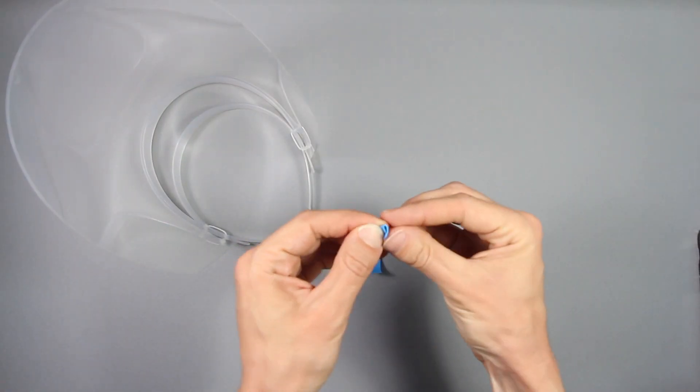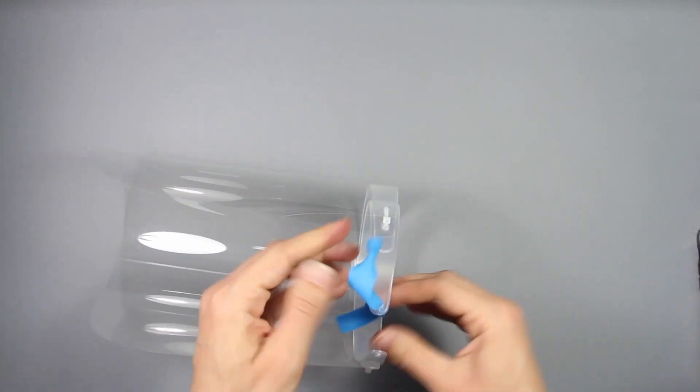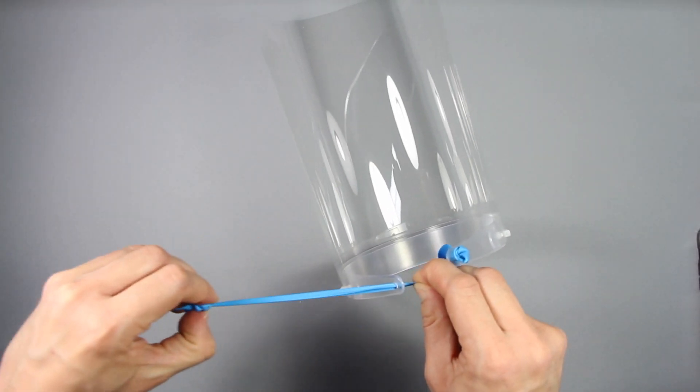Thread the end of the tourniquet band through the hole in the end of the headband. Then tie a knot or two to secure it in place. Repeat on the other side.